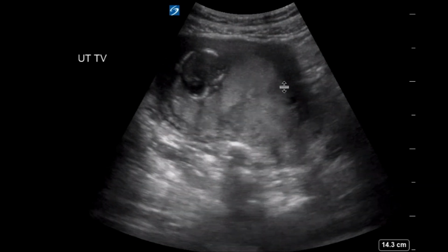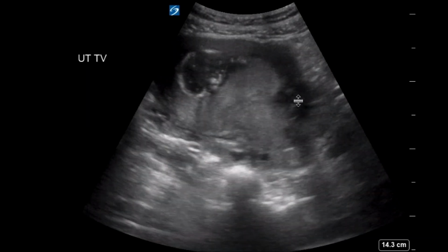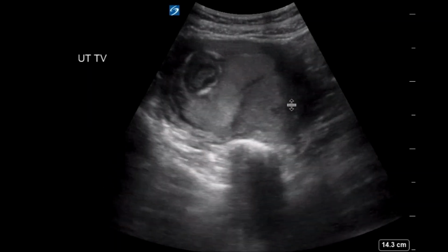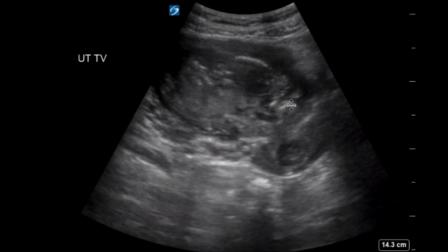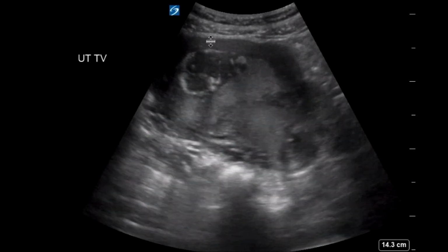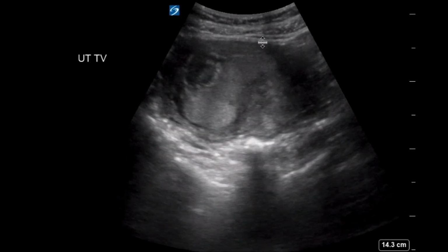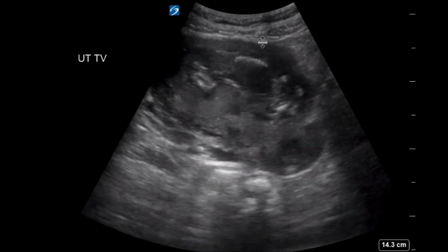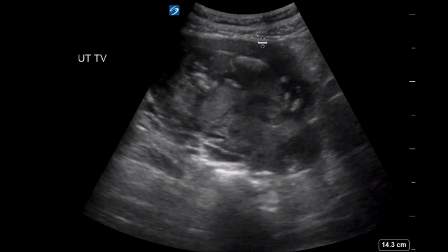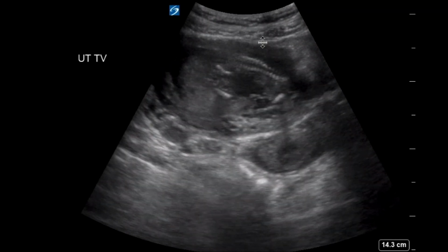One of the things that we're looking for is the amniotic sac, and in this individual, it looks like we're not seeing that large black surrounding sac that we would expect, which is concerning for this fetus. So if you were speaking with the obstetrician, how would you describe the amniotic sac findings here? Well, we would say that it's non-existent, or two words to use would be oligohydramnios or anhydramnios, and that there is little to no amniotic fluid in this individual.